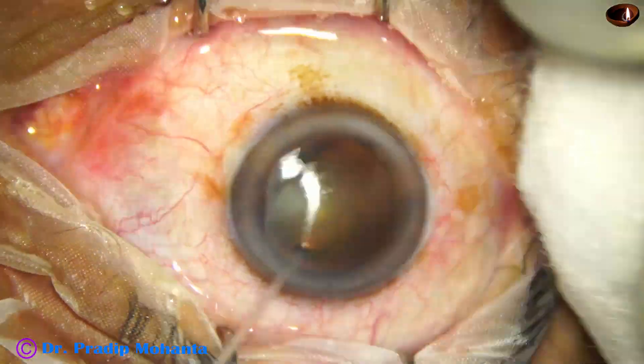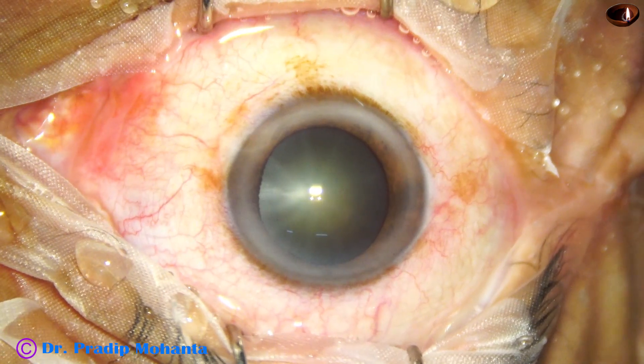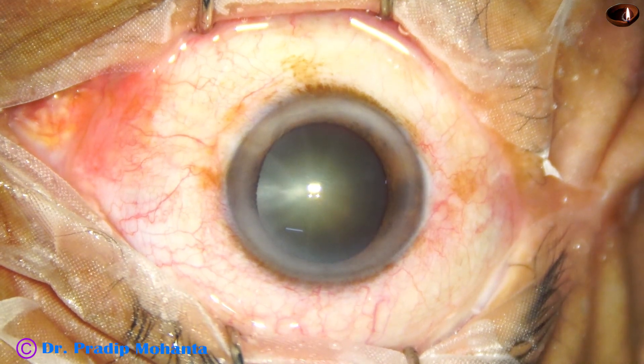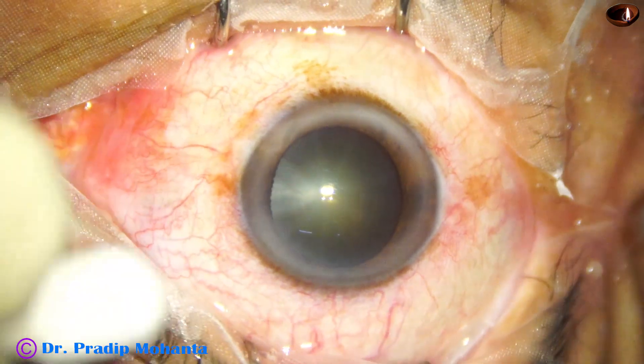This is a cataract with grade 2 nuclear sclerosis. The ocular surface is thoroughly prepared. We have instilled a few drops of povidone iodine and irrigated the ocular surface with BSS.